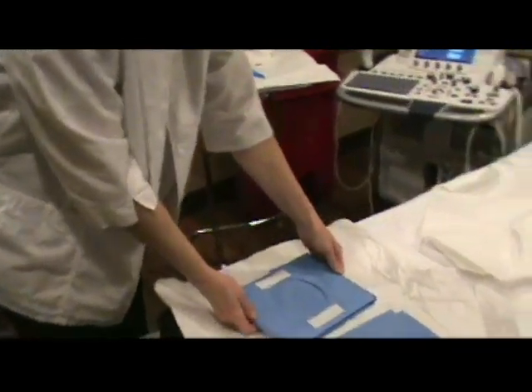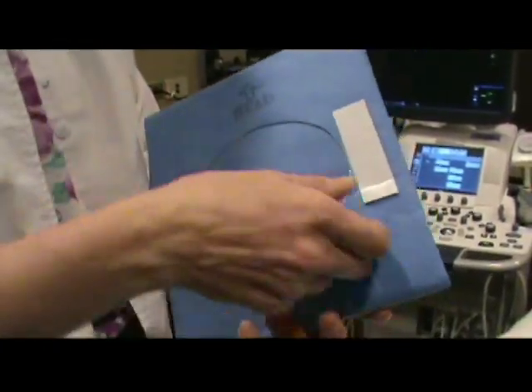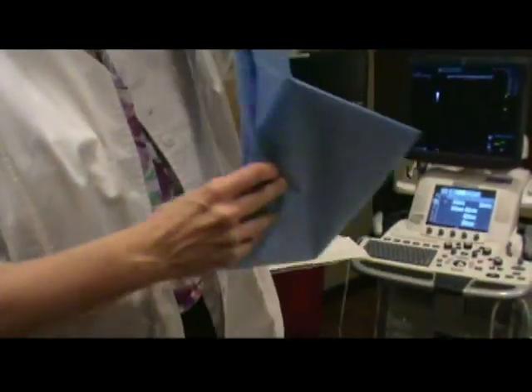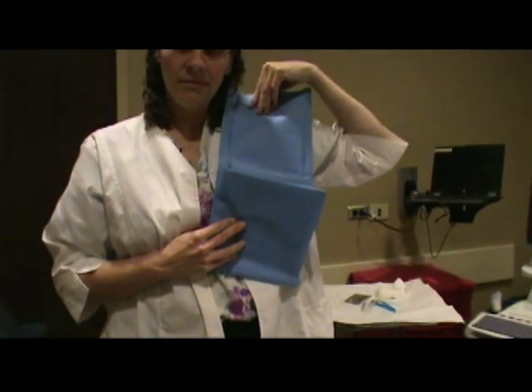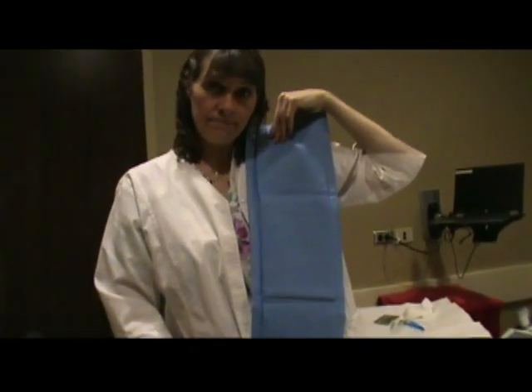The new change is this. So virtually the head is right here. You can take the tabs right off and virtually just place it onto the patient. So it's a much easier directional than the previous.